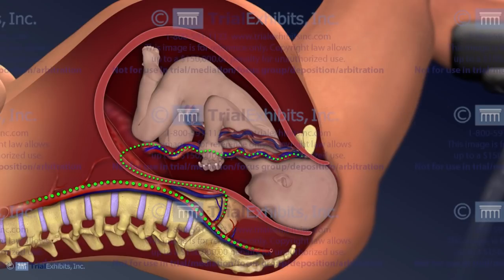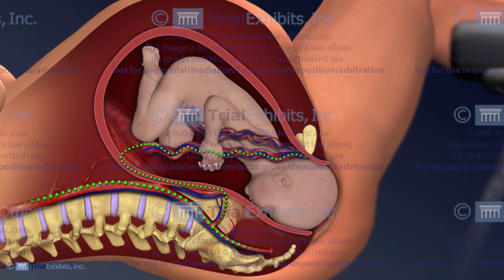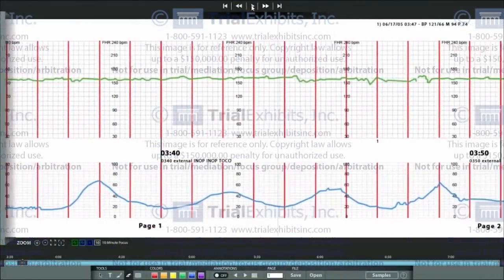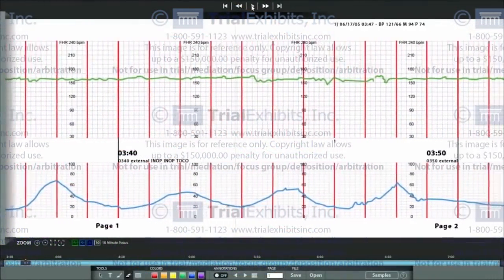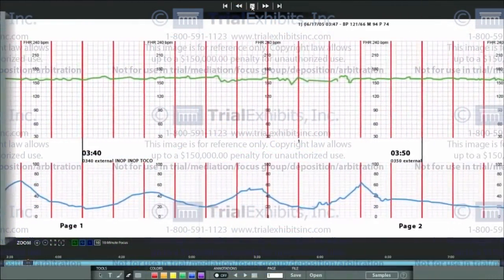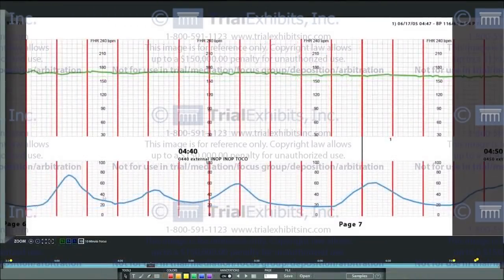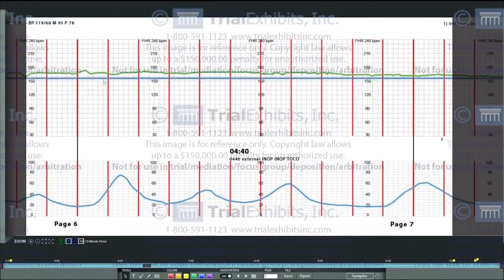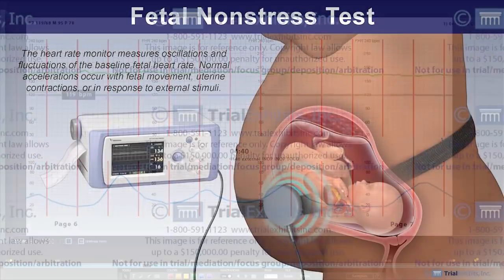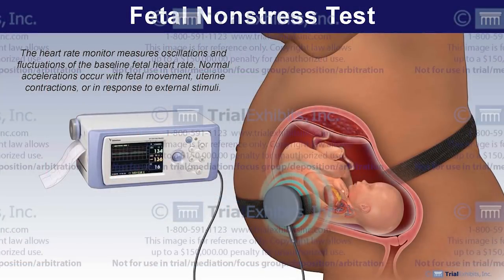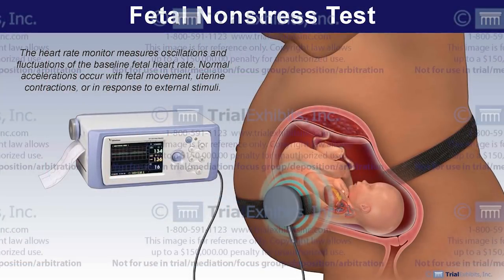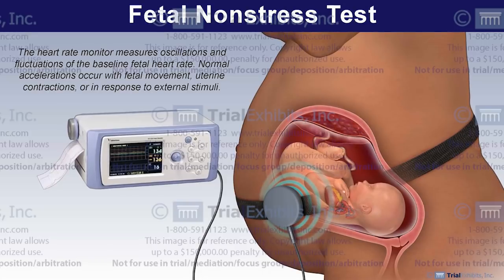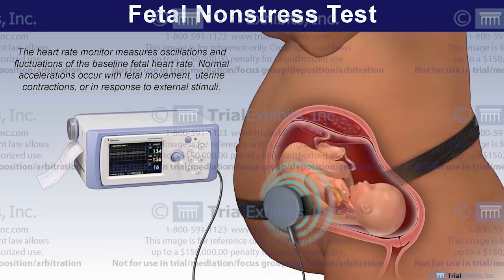In addition to the animation detailing our theory of events in this case, it was essential to present the only actual evidence of the events that occurred within the womb. This evidence was found in the recorded fetal monitoring strips. A fetal monitor is a device placed on the outside of the mother's abdomen that records both the fetal heart rate and the mother's contractions.